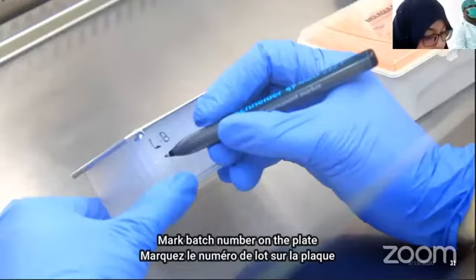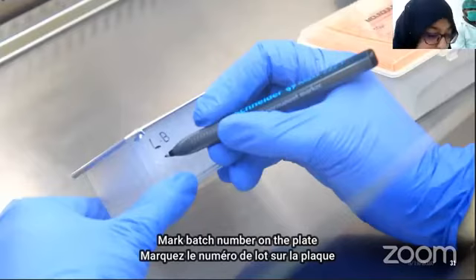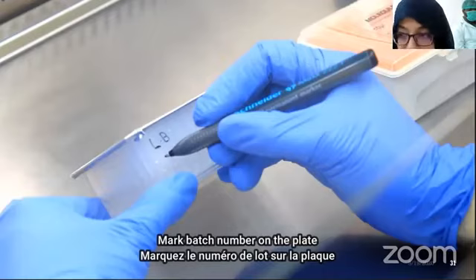Can you mention the reference SOPs that you have followed? The samples are processed according to the kit instructions. For RNA extraction, we follow the kit instructions on what to add: initially this, then the RNA, and then this and this. If you are talking about the safety SOPs, we follow the WHO recommendations, CDC recommendations, etc.